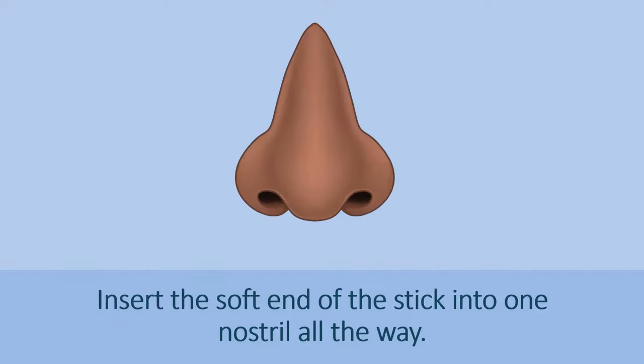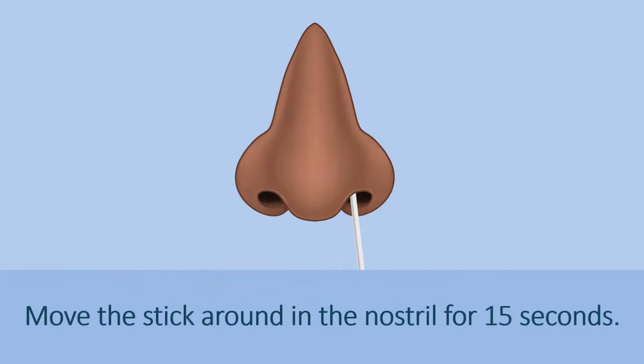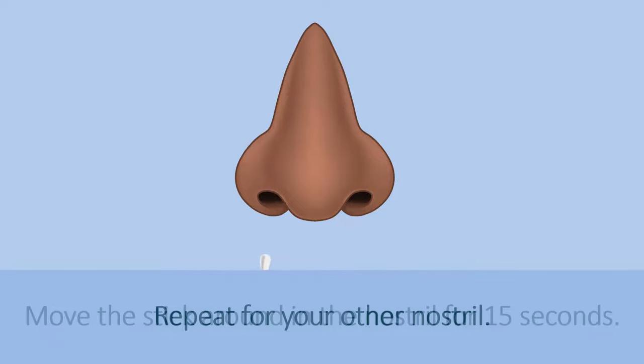Insert the soft end of the stick into one nostril all the way. Move the stick around in the nostril for 15 seconds. Repeat for your other nostril.